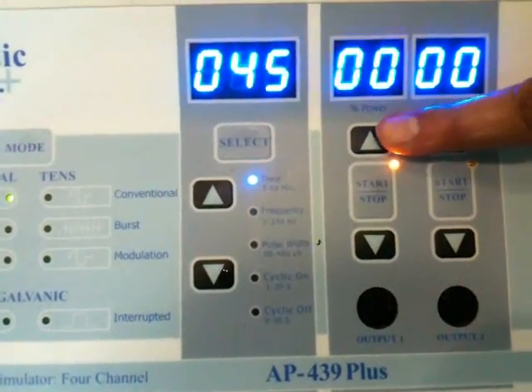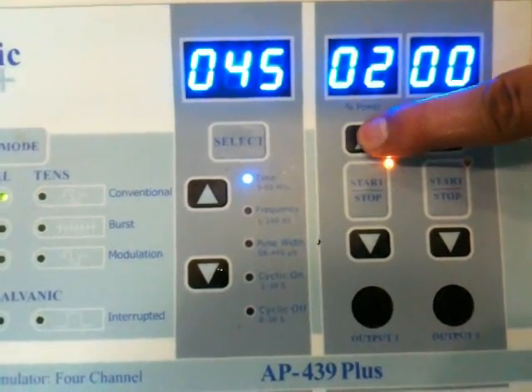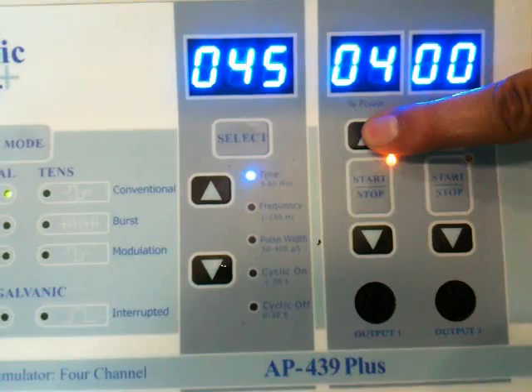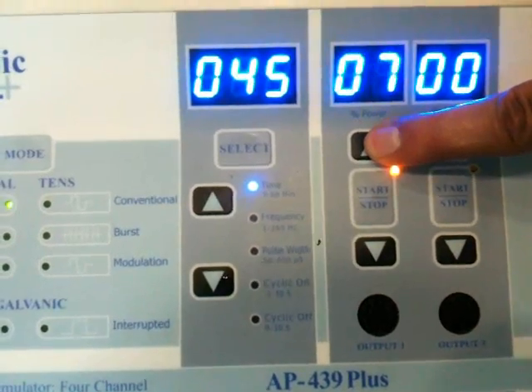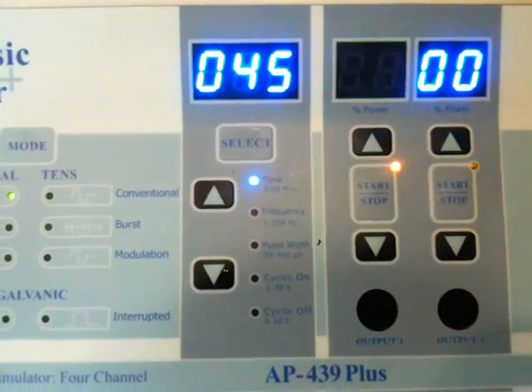Now the window is activating, blinking the intensity, and rising the intensity.